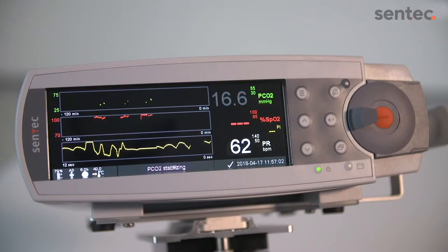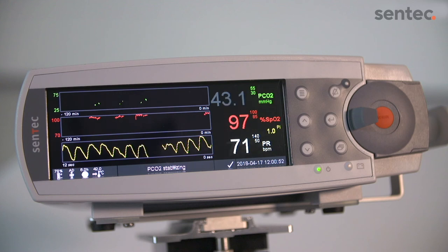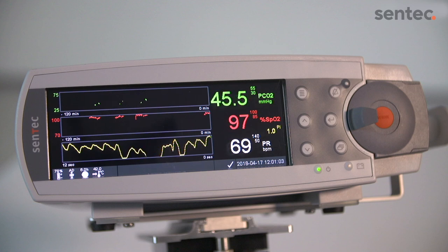Once the Sentec digital monitor detects that the sensor is on the patient, it will initiate monitoring. The transcutaneous readings typically stabilize within 2 to 10 minutes. As soon as the enabled parameters stabilize, the displayed readings will change from grey to the selected color.